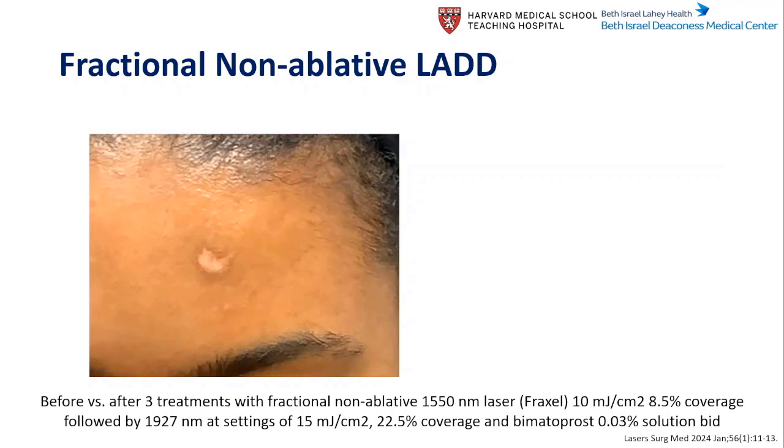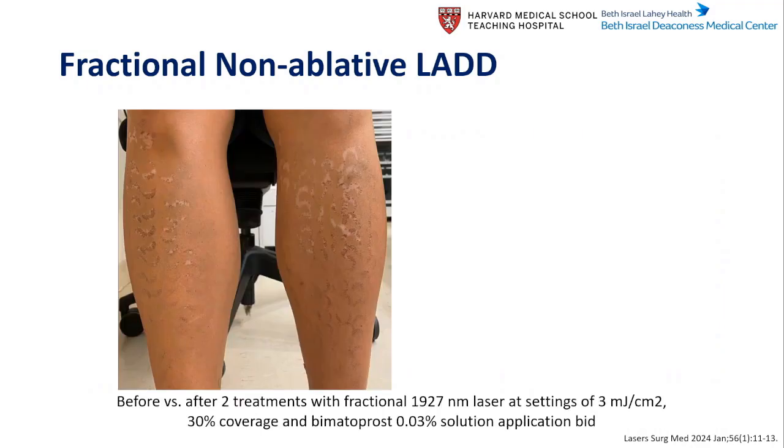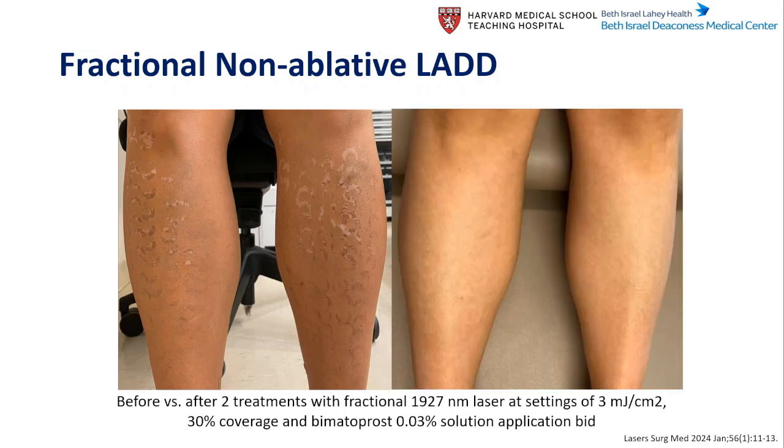And this patient, we did the same technique, but required 3 sessions. My patient, I also prescribed bimatoprost, and then she received the 1927 twice. And she also kept using it for several weeks, and this is 8 weeks after the second treatment.